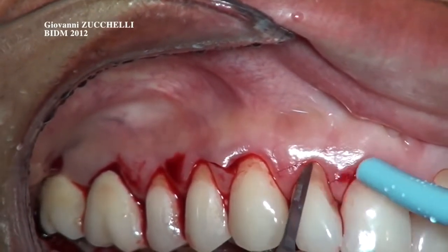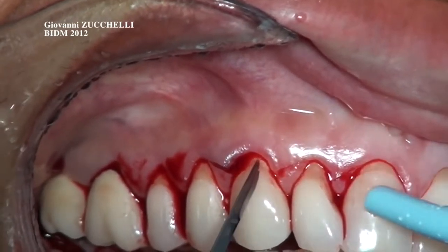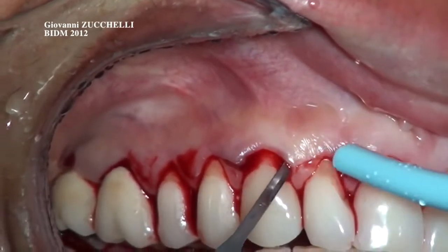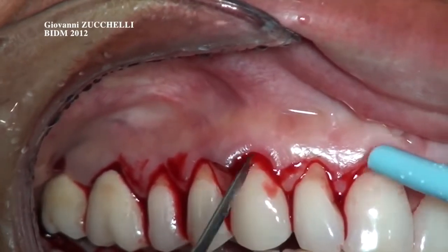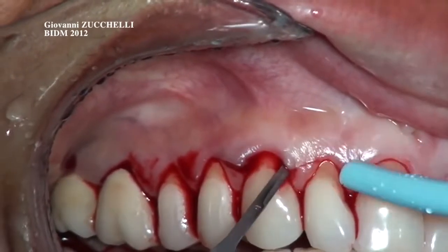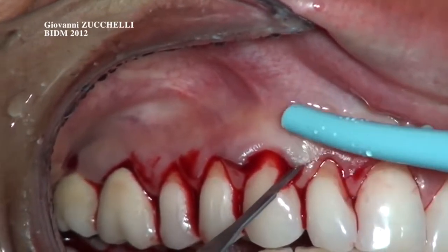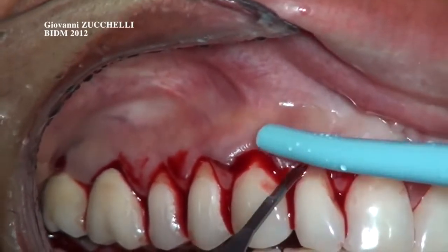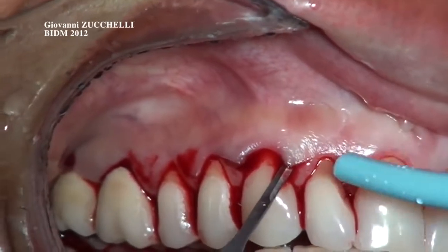Now I'm going to do the same thing, split thickness surgical papilla in the second incision line. It's very important, please, to keep the vertex, the tip of the papilla, in the right position. Don't lose the tip of the papilla.